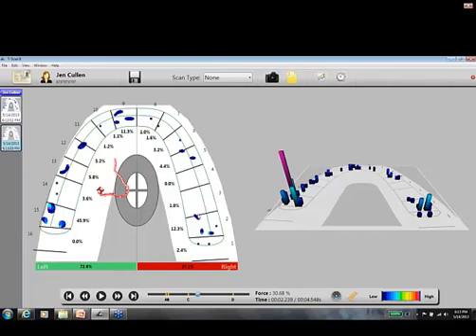So this is the things you're looking for, and I know you guys are doing this in your practice, but I wouldn't like that number 2 hangs in there. And number 15 has 45% of the force on it. If I had an ideal bite, I should be up here. So these are the things that you're going to talk to your patient about. See, I just kind of hang out on 15 for a while.